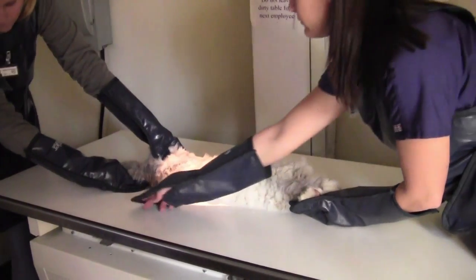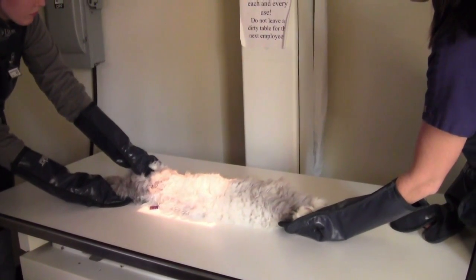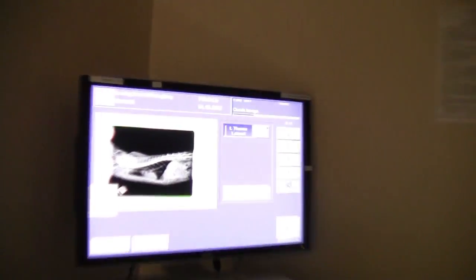Make sure the right or left marker is present in the radiograph but does not interfere with the point of interest. Thoracic X-rays should be taken in inspiration to inflate the lungs and allow better contrast between the soft tissue of the thoracic cavity. Unless pneumothorax is suspected, then it would be suggested to take an X-ray on expiration.